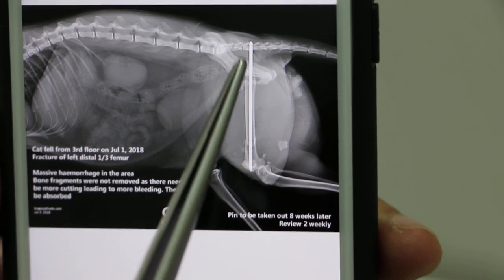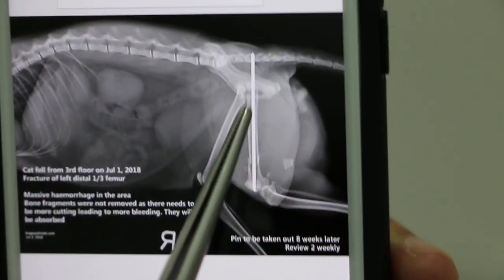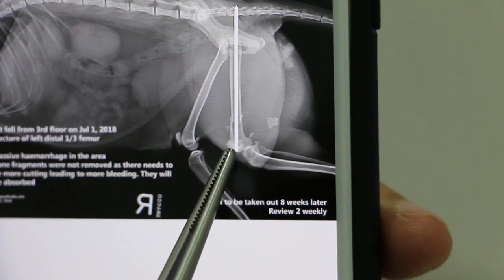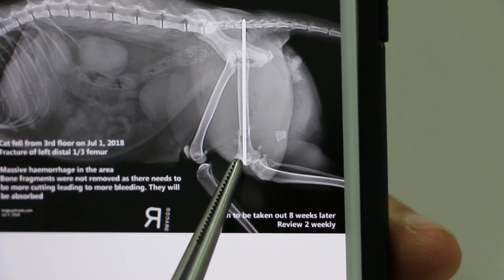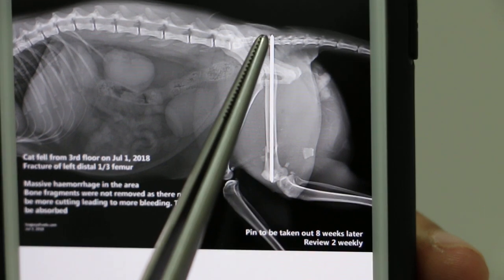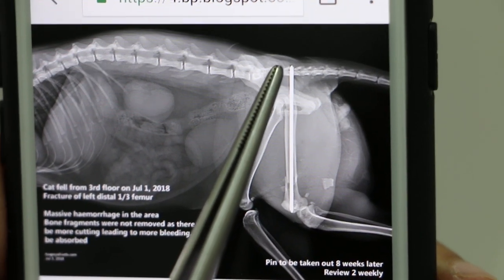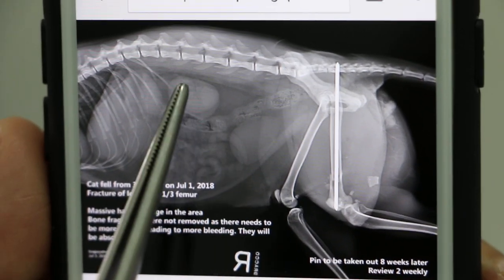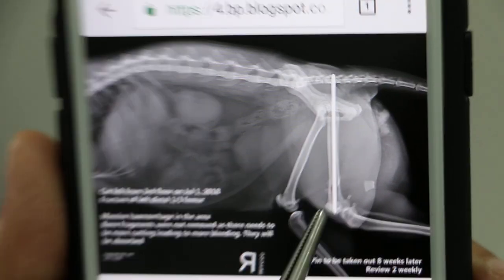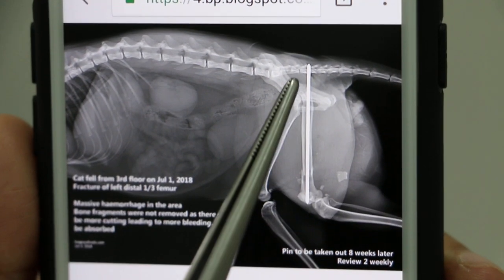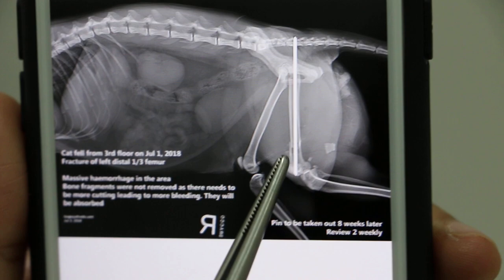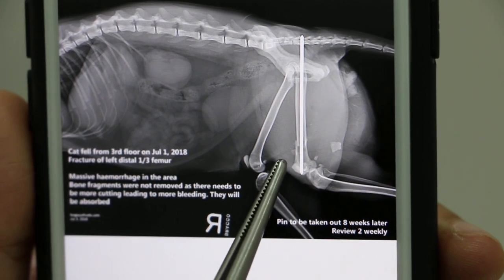You can see the pin just rests on the condyles. There are the condyles, and then the pin goes up through to the hip — the trochanteric fossa — and it will be there. This is the x-ray after insertion of the pin.